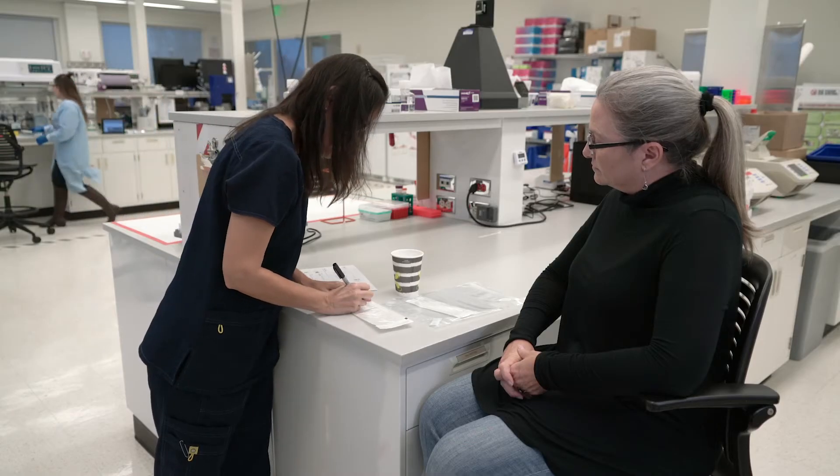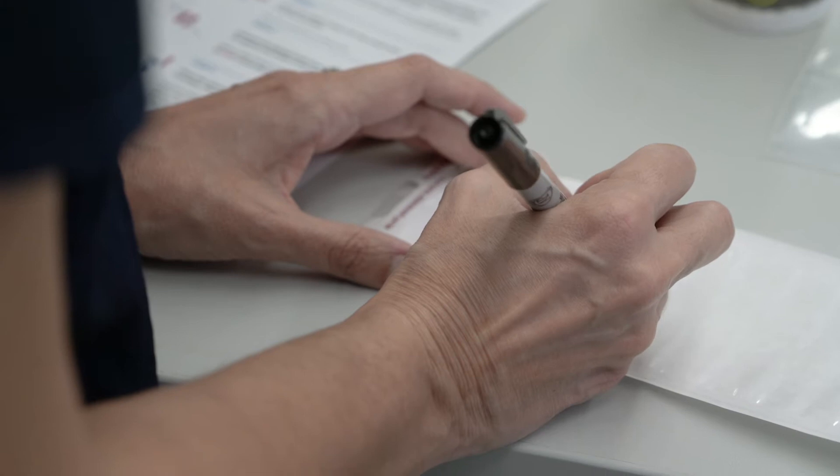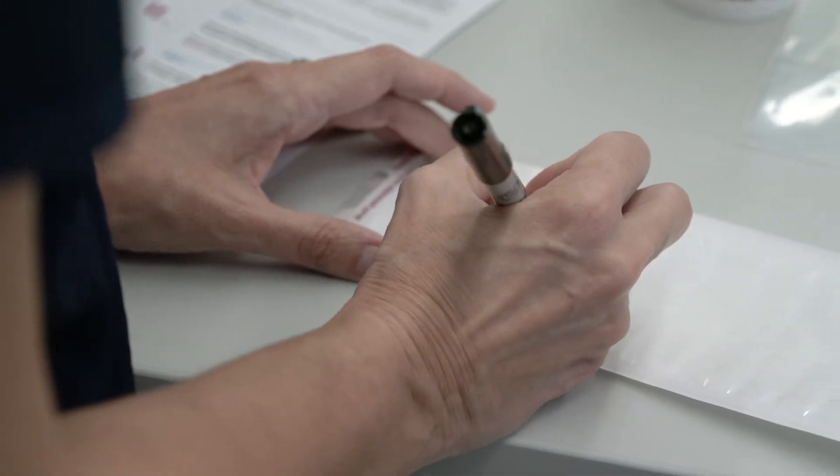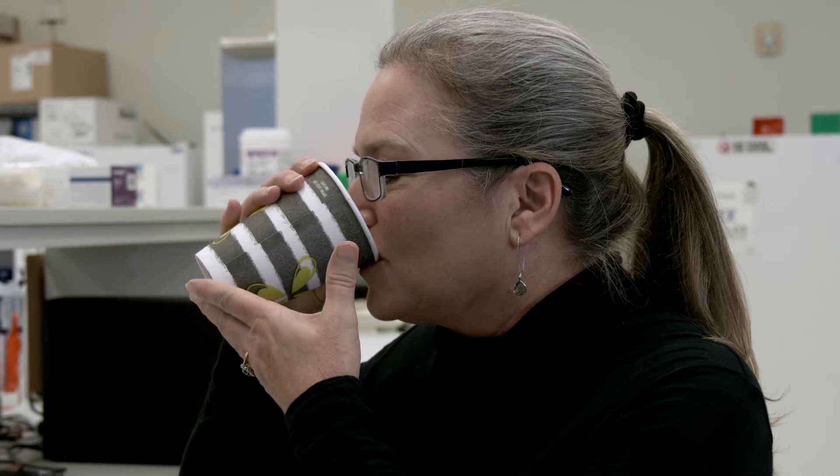First, complete all the patient and date information on the small clear dry pack envelope. A fine point Sharpie works well — please write clearly and legibly. Next, have the subject rinse their mouth well with pure water.